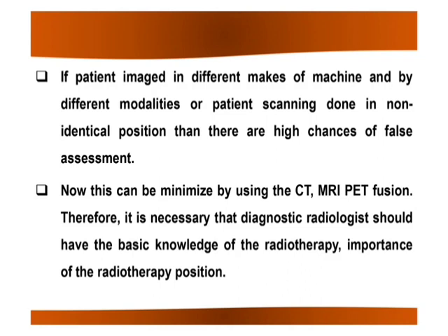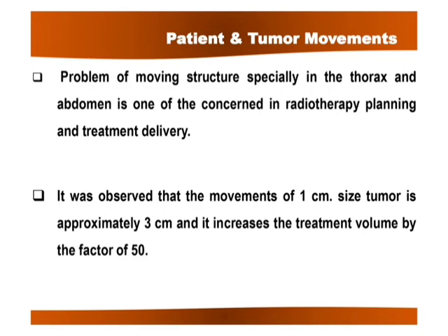In the same position, a different marker, a different shape marker, is put for the MRI simulation, and then you acquire the image. Now both the CT and MRI images, scan by scan, wherever having a tumor, should be overlapped, and then the CT MRI fusion image is created. That is what I wanted to tell you.